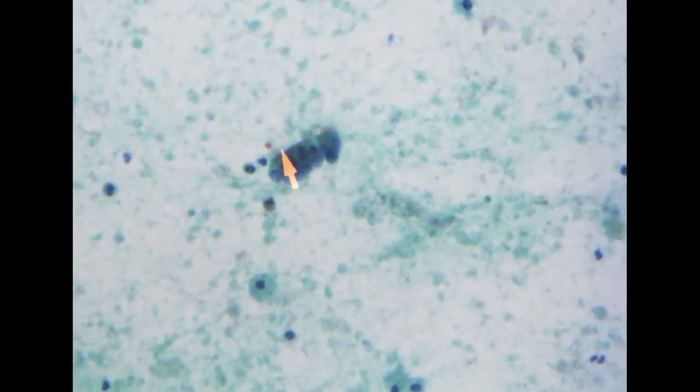Both cysts can be composed of respiratory type of epithelium. In this specimen, this is not common. We rarely see it. Usually, we will only see the cystic fluid, but in this specimen, they did sample the ciliated respiratory epithelium. So this is compatible with thyroglossal duct cyst.